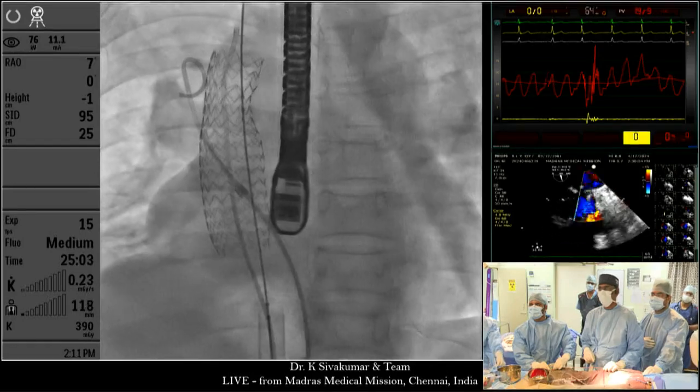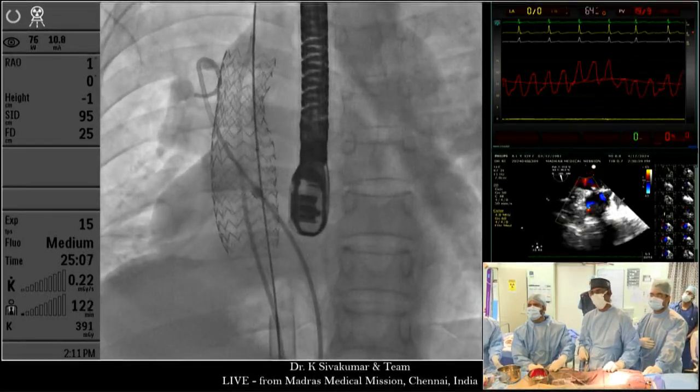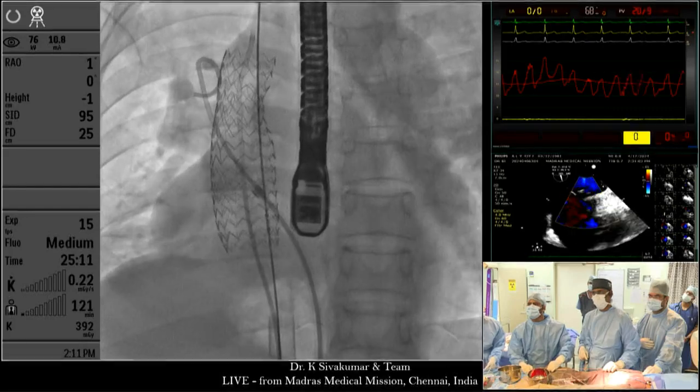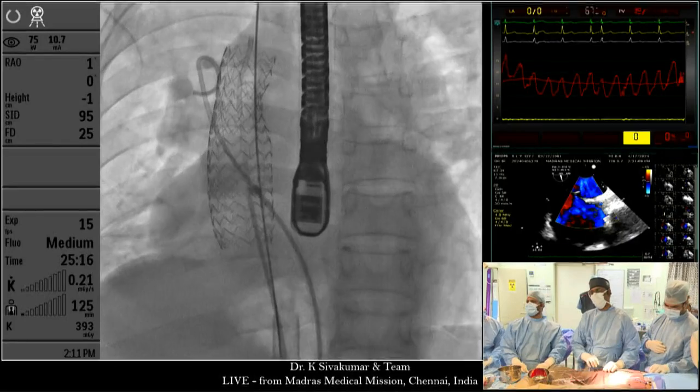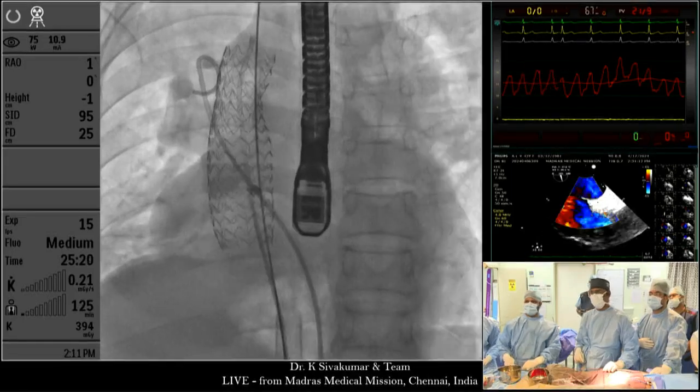Hey, Siva, this is Hoveida. This is an impressive case. Why is her right diaphragm paralyzed? Did she have something done? And is that why the stent looks like it's pretty far down? Just her right diaphragm is quite elevated. Yeah, it's not moving much. However, that's a nice observation. Probably there is something like an eventration.